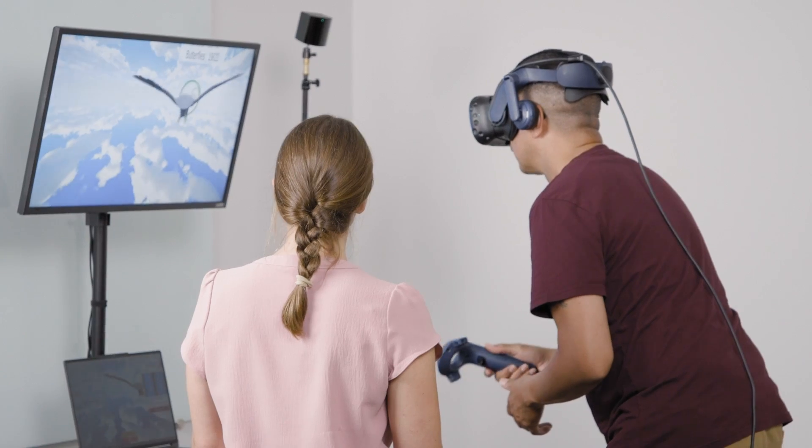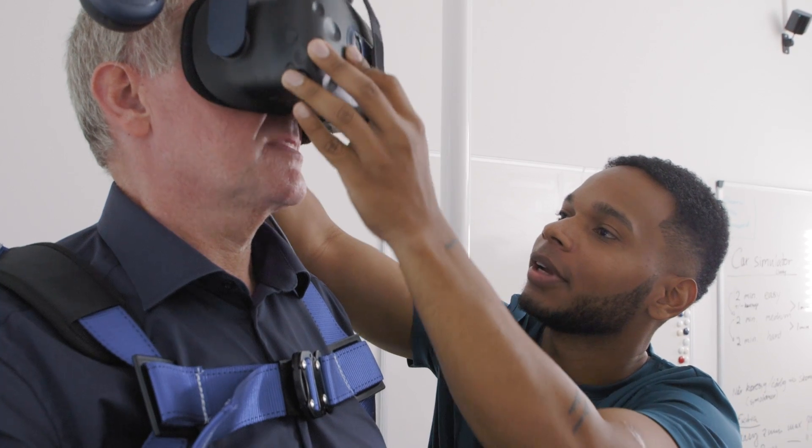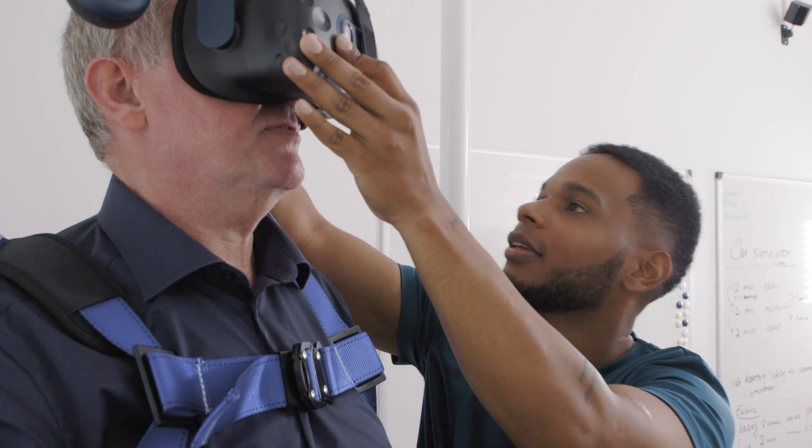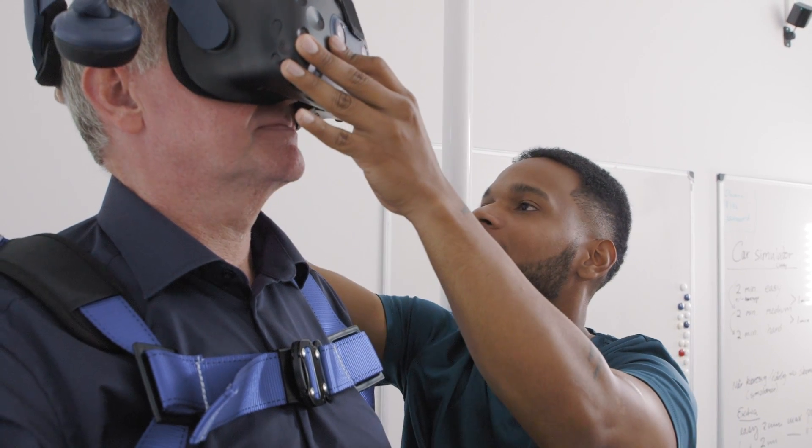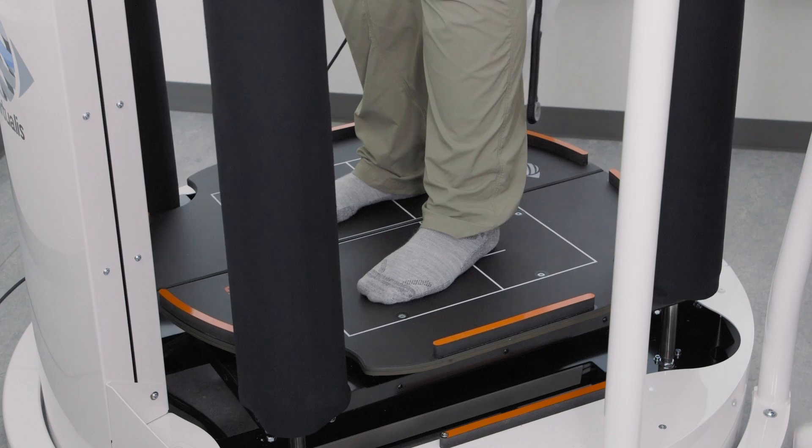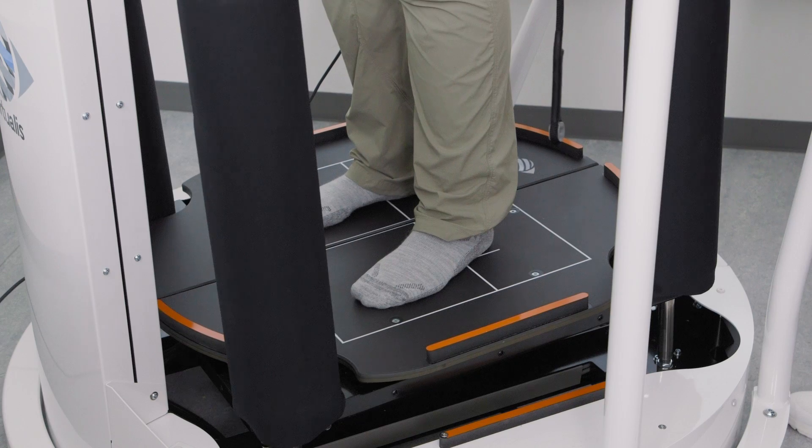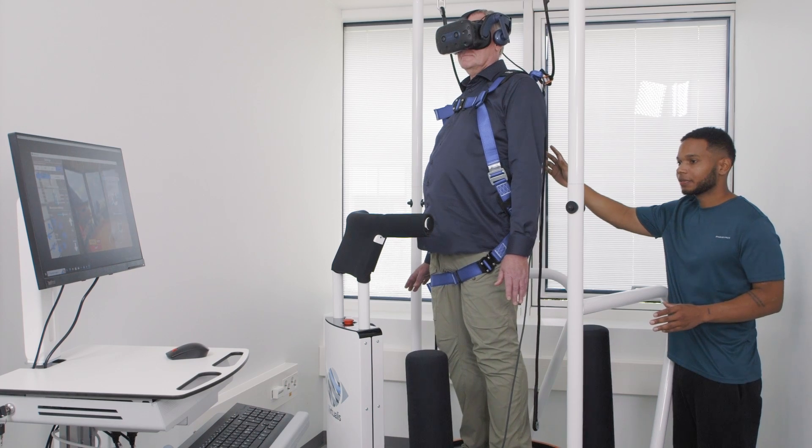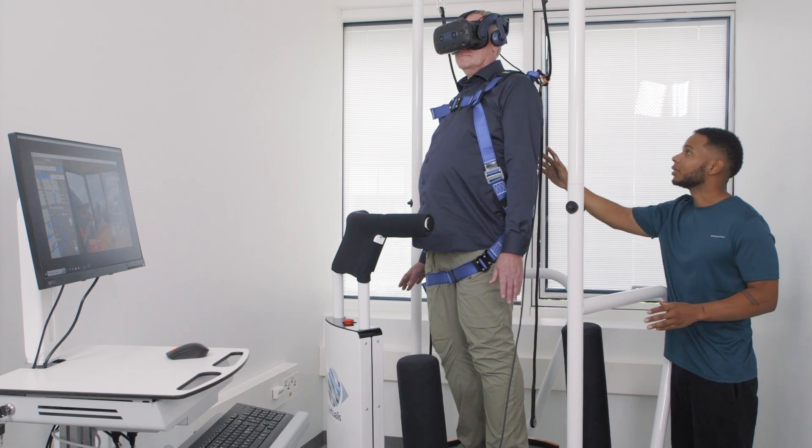Virtualis is a line of unique balance rehabilitation solutions using virtual reality to help people with balance disorders train their balance.